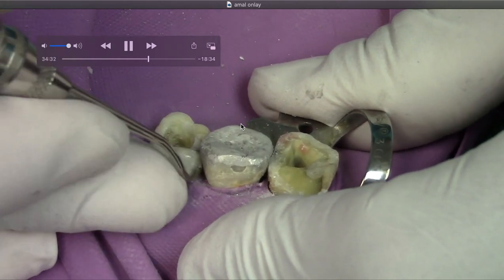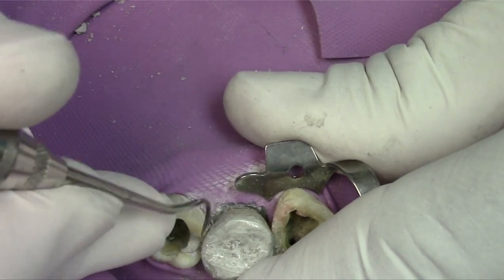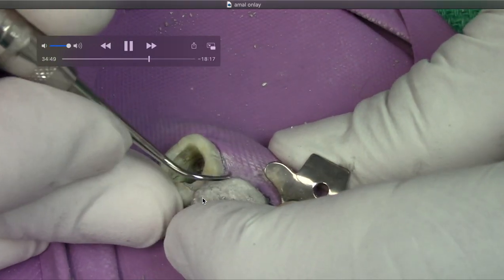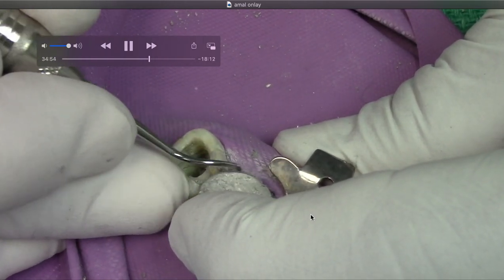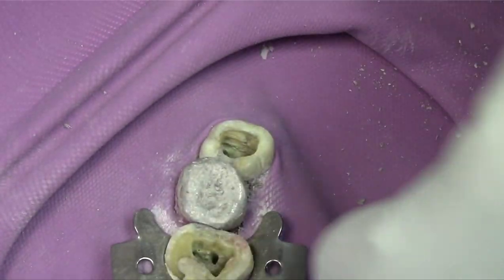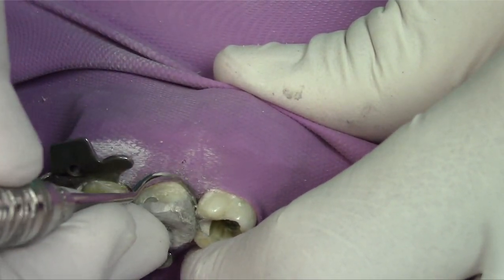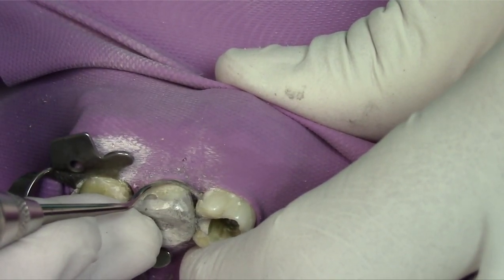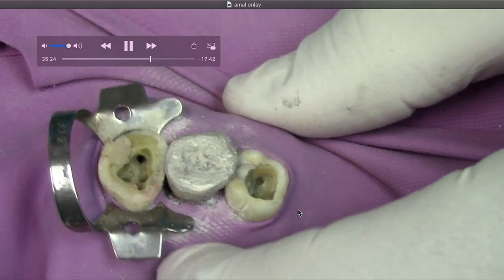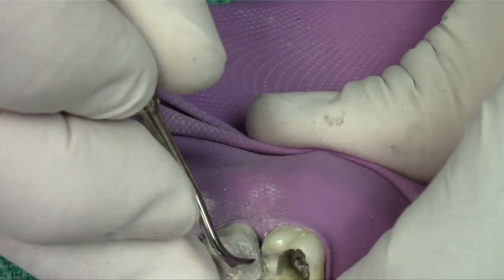I've still got this bent-nickel look on the occlusal — haven't adjusted at all. I'm going to slowly use a round bur because it's starting to harden up and set. The restoration might look like the surface of the moon when we've got it in occlusion, but the gingival health is good. In real life, that contact and gingival embrasure with no overhangs is really what's important. What you're seeing that looks darkened is actually just old composite now being stained by the amalgam.